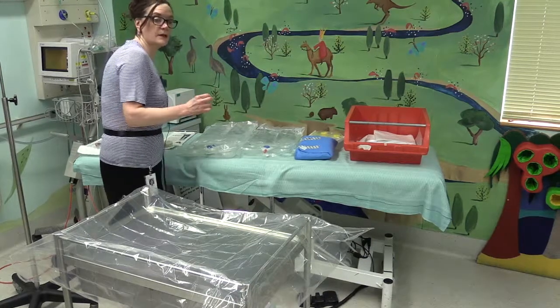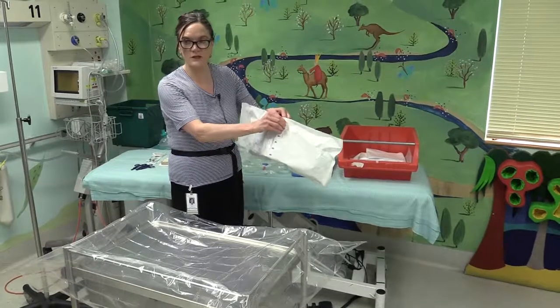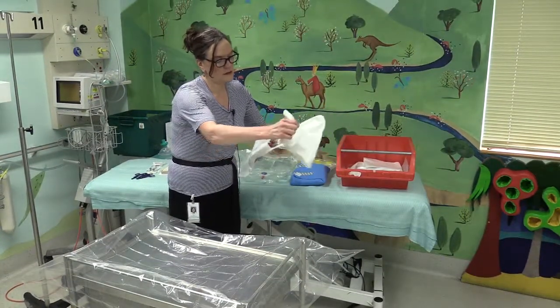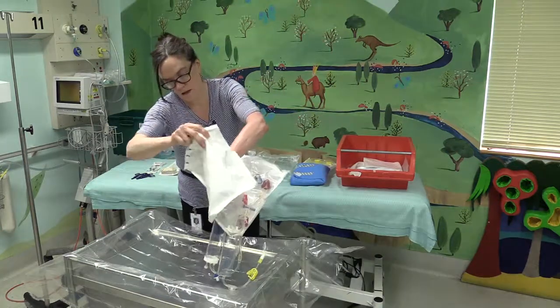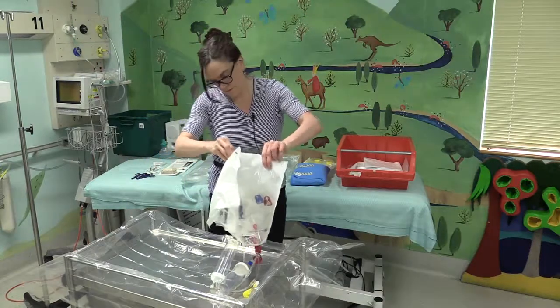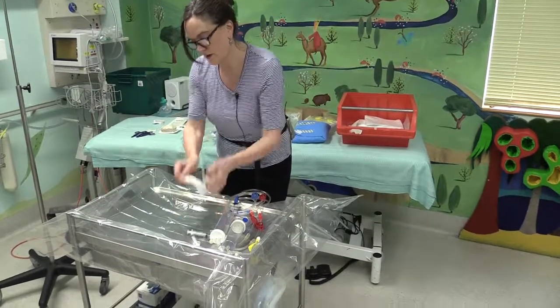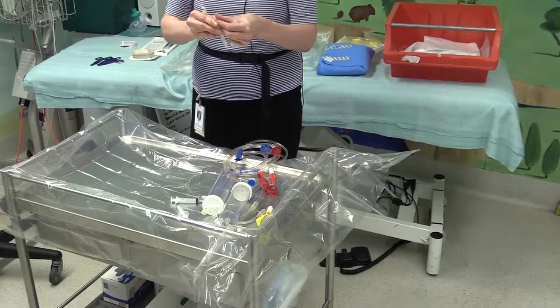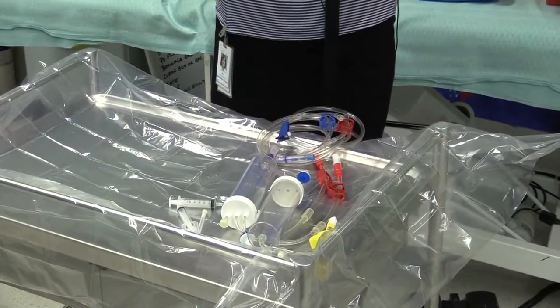I'll start by peeling open the peritoneal dialysis packet, making sure not to touch it. Needles for the heparin.